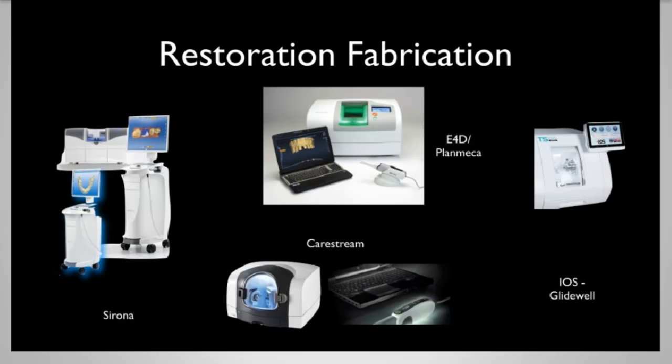In the restoration fabrication world, there are 4 key systems in the U.S. and many more that will come about. Sirona, a fantastic system, has been around for a long time, and the CEREC platform does a really nice job. You have the E4D or Planmeca system. You have Carestream, formerly known as Kodak, that has created an intraoral scanner as well as a milling system. And then finally, Glidewell, one of the big laboratories here in the United States, has come out and partnered and essentially took a controlling stake in a system called the iOS Glidewell, or TS150 milling system. All these can create restorations. In this iOS system's case, it can be merged with other scanning technologies.